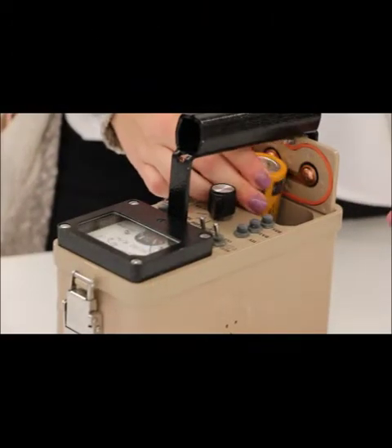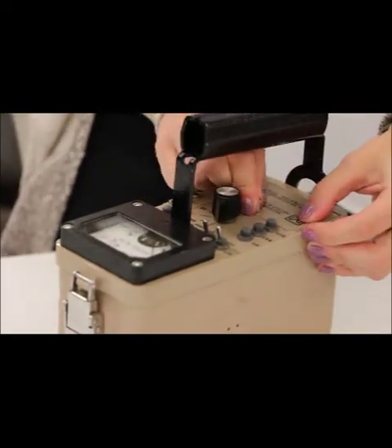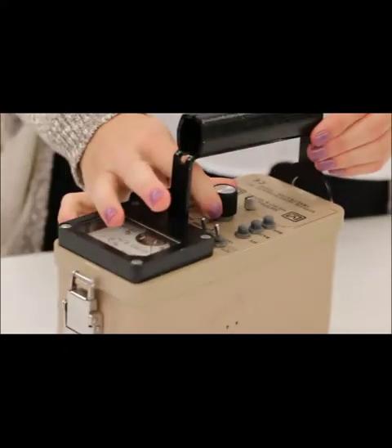D-cell batteries must be installed in the battery compartment. Be sure to insert them with the correct polarity as indicated on the battery lid.